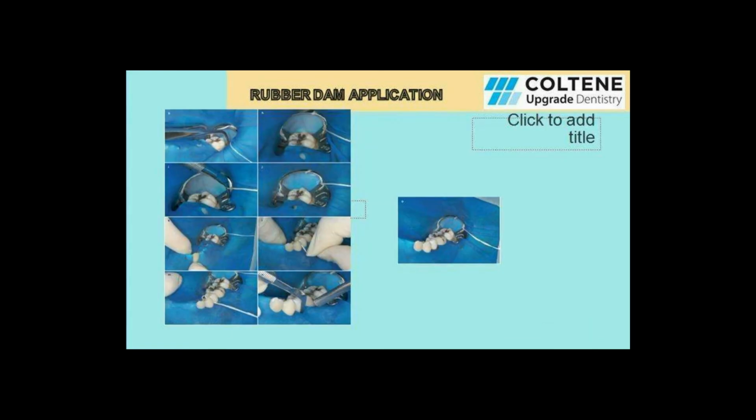Now, continuing with the same application method, the first picture shows the forces which we applied to the clamp, and that clamp along with the rubber dam frame and rubber dam sheet has been placed onto the tooth which was supposed to be clamped. The very next picture shows how the clamped tooth appears. The third picture shows that a blunt-ended instrument is being used to free the wings of the winged clamp from the rubber dam sheet so that the sheet doesn't get torn. The fourth picture shows how the clamp and the tooth appear when you have freed the wings from the rubber dam sheet.